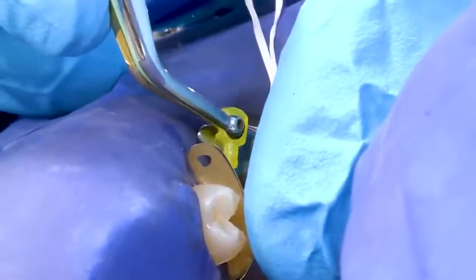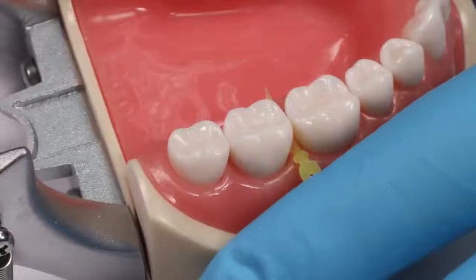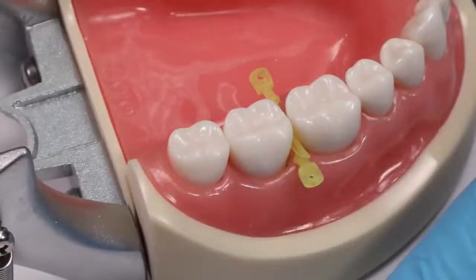Light finger pressure may need to be applied to the sectional matrix to prevent it from being dislodged during wedge placement. If needed, an additional wedge may be stacked to provide greater adaptation to gingival cavo surface. Wedges can be placed after ring placement if desired.